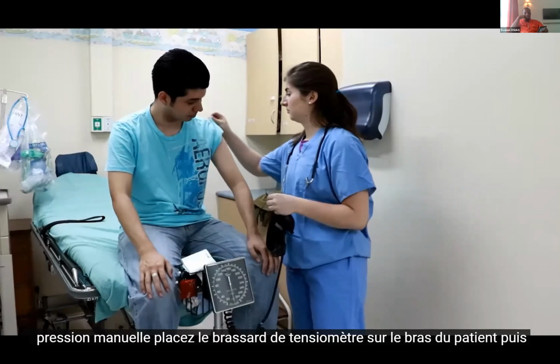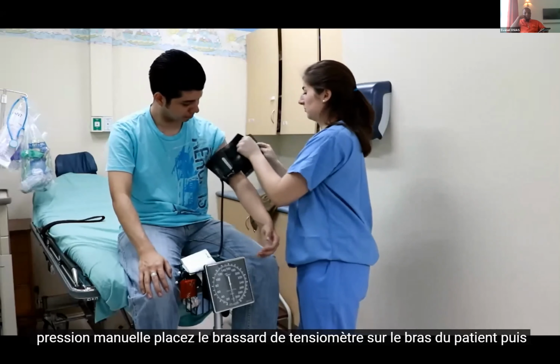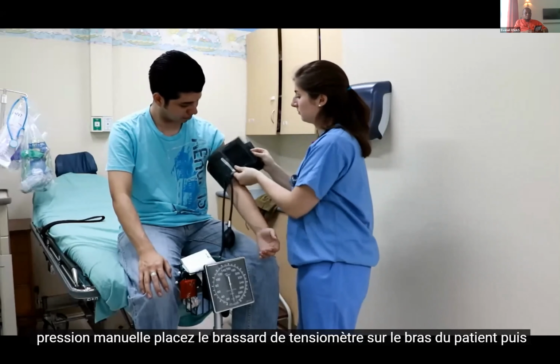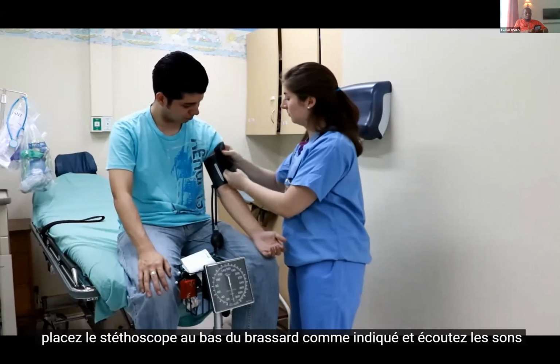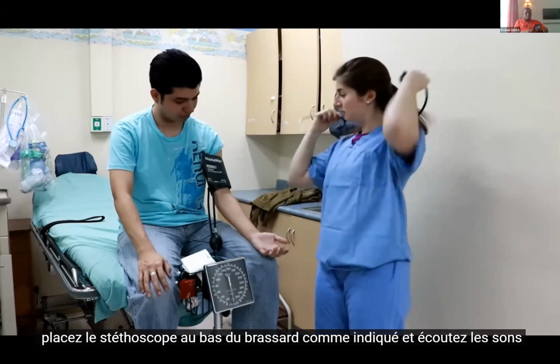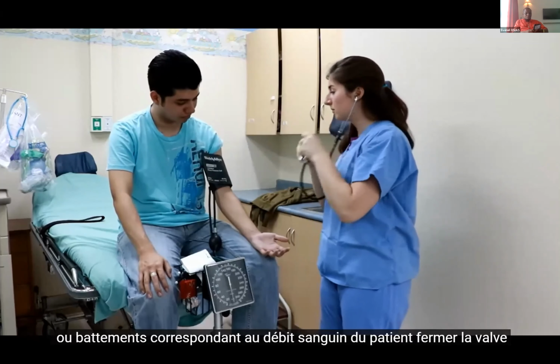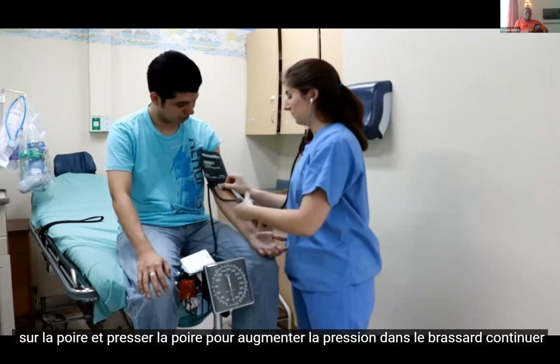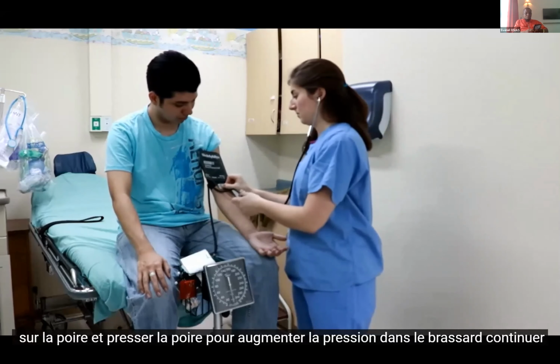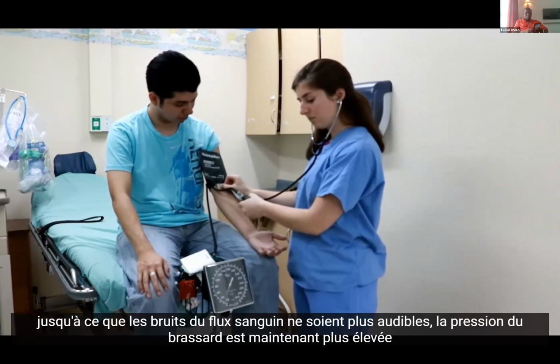To measure blood pressure manually, place the blood pressure cuff on the patient's arm. Then, place the stethoscope at the bottom of the cuff as shown and listen for sounds or beats corresponding to the patient's blood flow. Close the valve on the bulb and squeeze the bulb to increase pressure in the cuff. Continue until sounds of blood flow can no longer be heard.